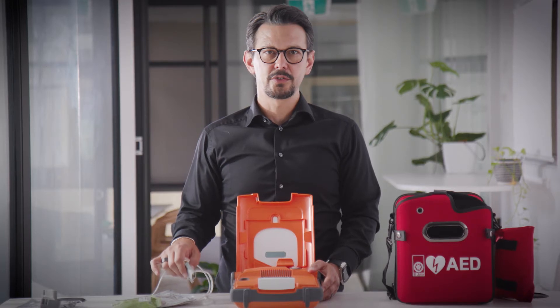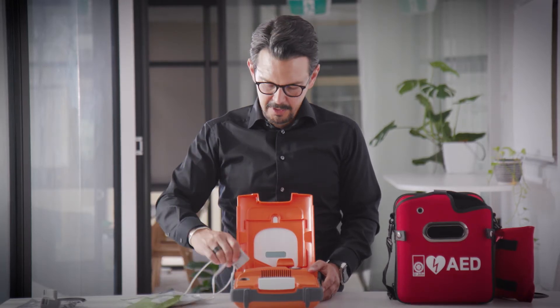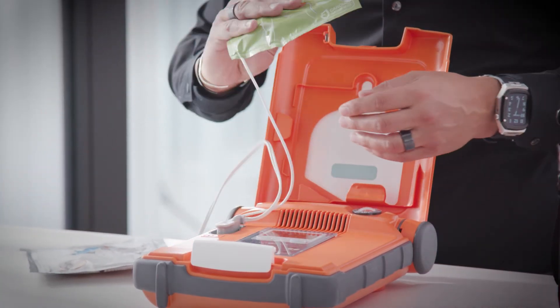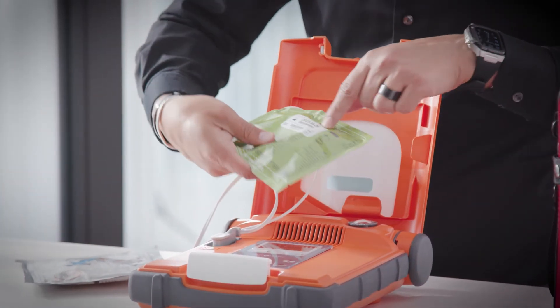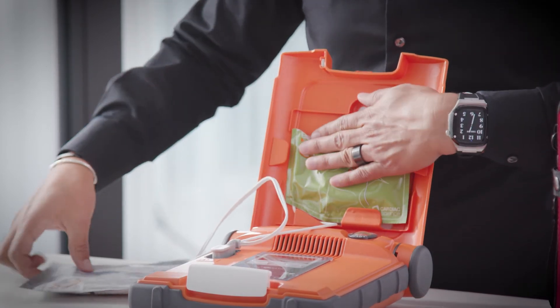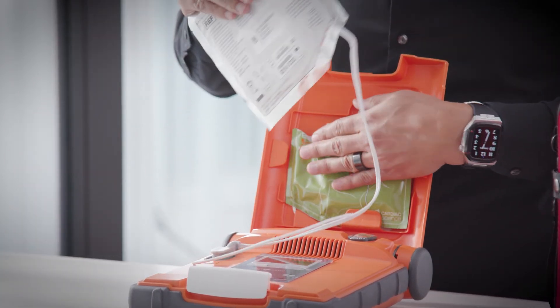To attach your G5 ICPR electrodes, plug in firmly. Place the green package with the expiration date through the window of the lid of the AED. Then place the electrodes on top.